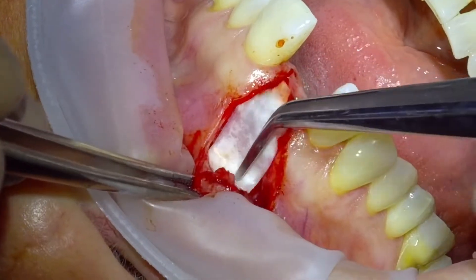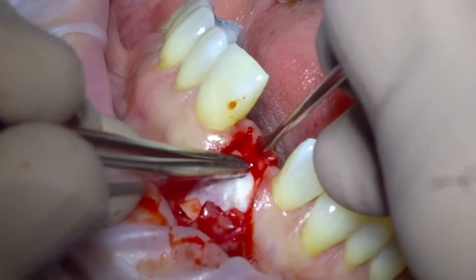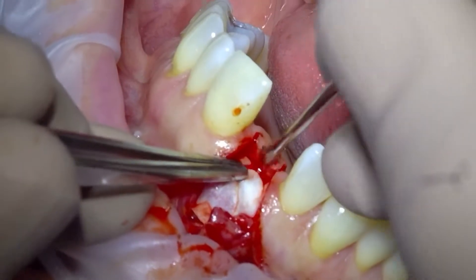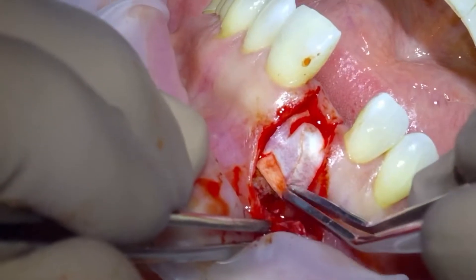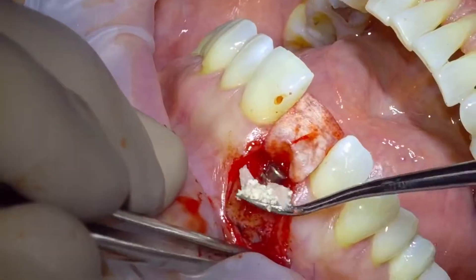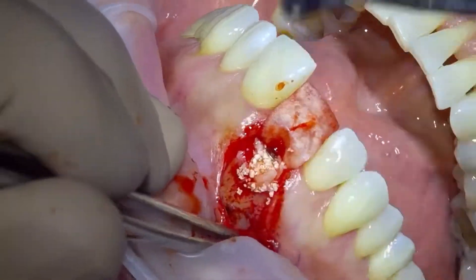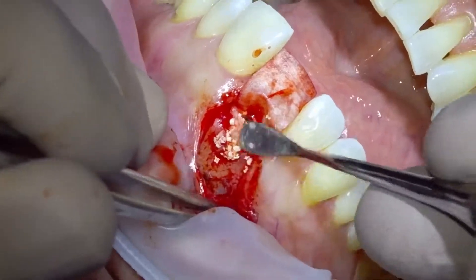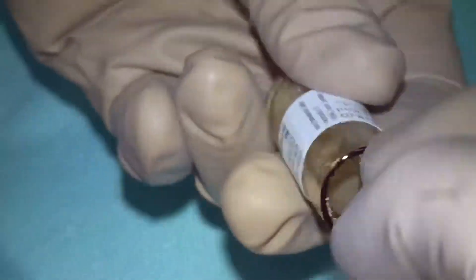I'm going to wet it through a pair of simple college tweezers and a Houser elevator. We can tuck it through on the palatal side. We need to add our graft particulates, so I'll just reflect the Jason membrane back. I like to make sure I've got the autogenous chips close to the implant thread surface, along with the mixture of Cerabone.